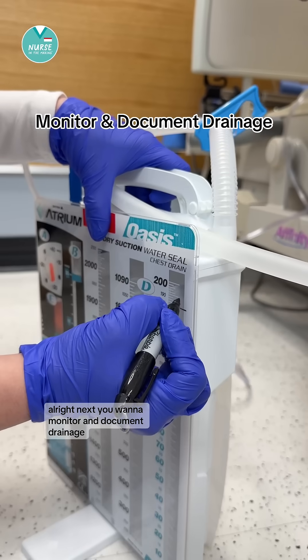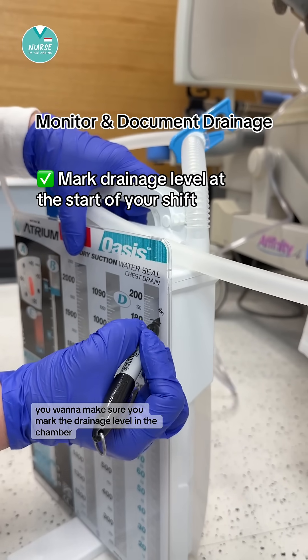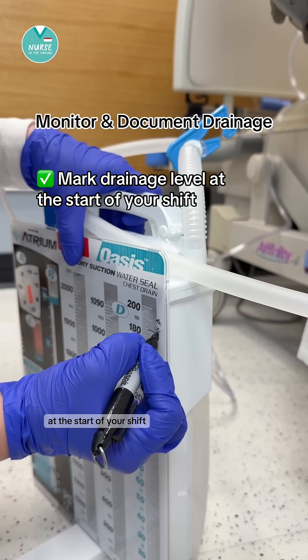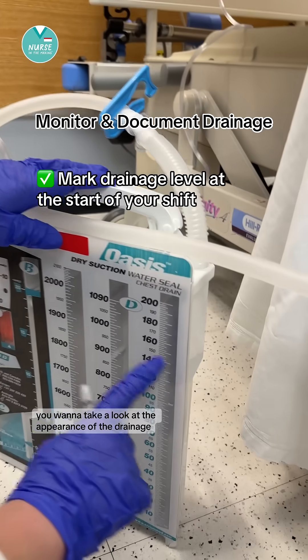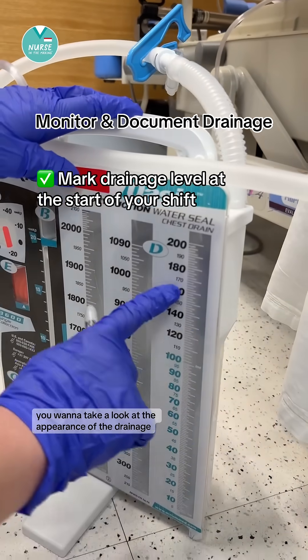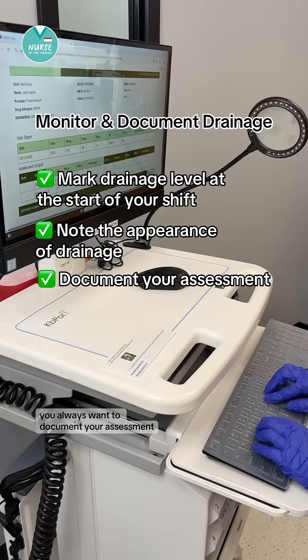Next, you want to monitor and document drainage. You want to mark the drainage level in the chamber at the start of your shift with the date and time so you can accurately measure the output throughout your shift. You want to take a look at the appearance of the drainage — is it serous, sanguineous, or purulent? You always want to document your assessment.